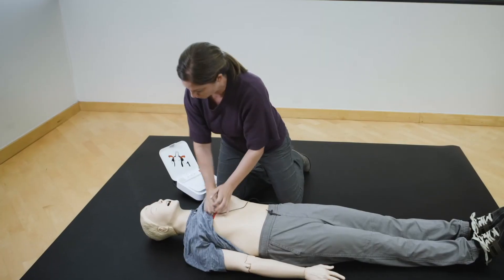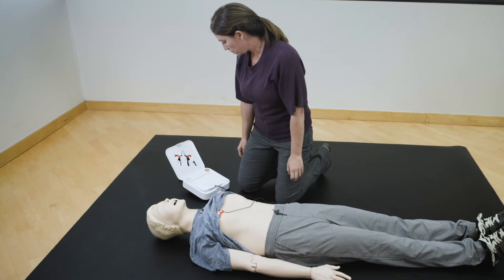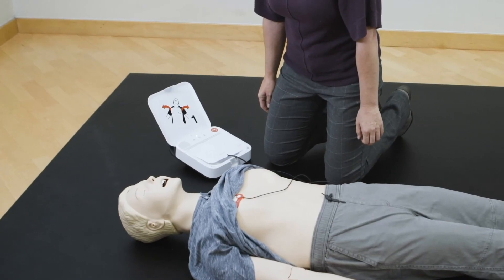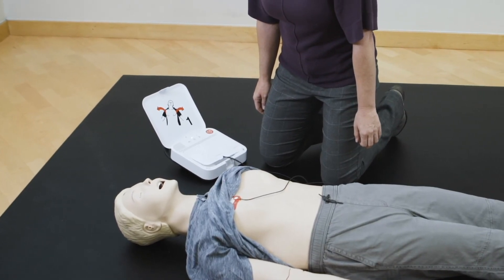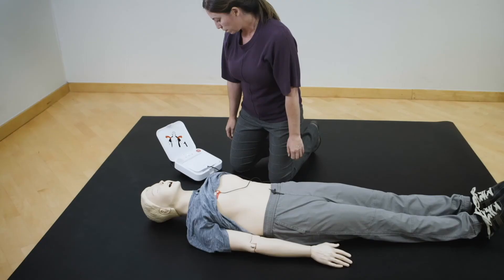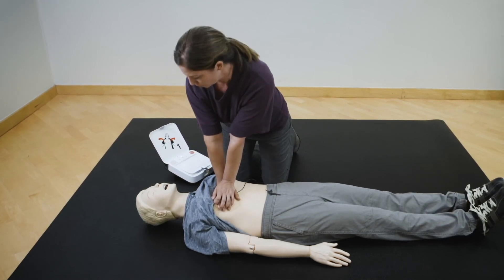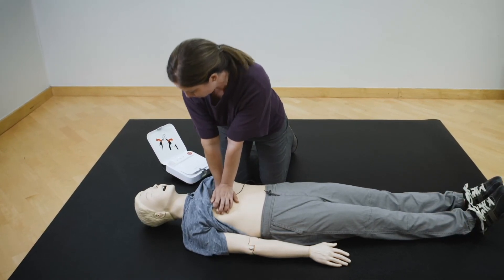Stop chest compressions. Everyone clear. Do not touch patient. Delivering shock. Shock delivered. Resume chest compressions. Push down hard at least two inches.